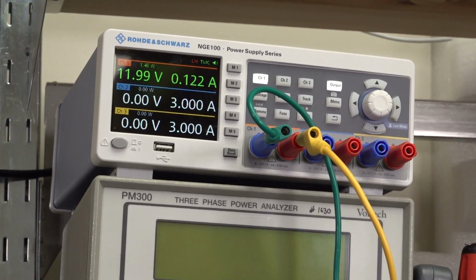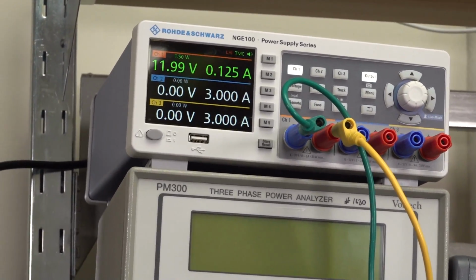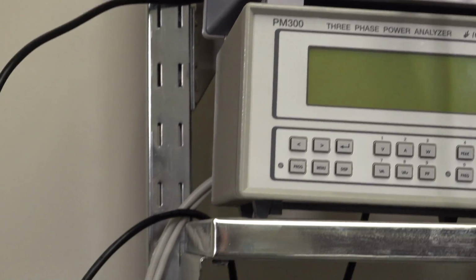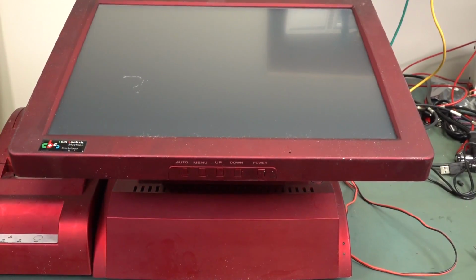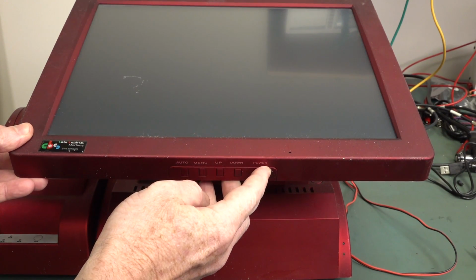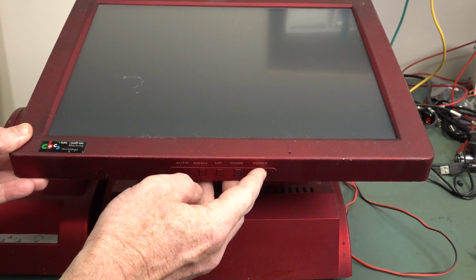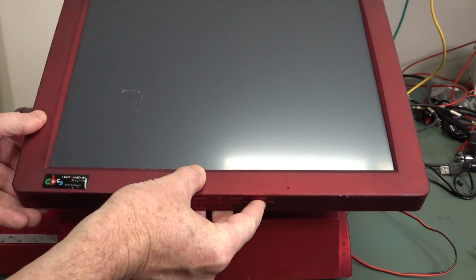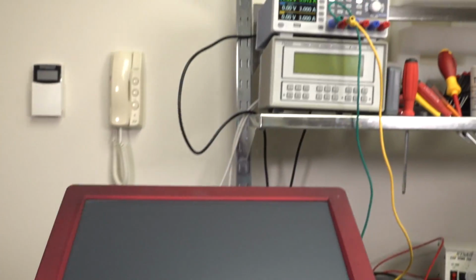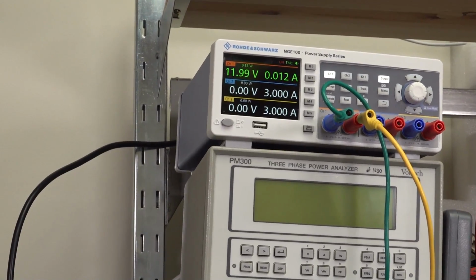Okay, I've got 12 volts fed into one of those inputs, the one that fitted the jack. I don't know what the other one is. 0.122 amps. That's actually pretty high for doing nothing. Anyway, there is a power button on this thing, and the monitor doesn't seem to have separate power. No, nothing doing there at all. I see no change in current. It's a mechanical switch on the printer, but that's it. Okay, the other jack here is 12 milliamps. That's more like your traditional standby.